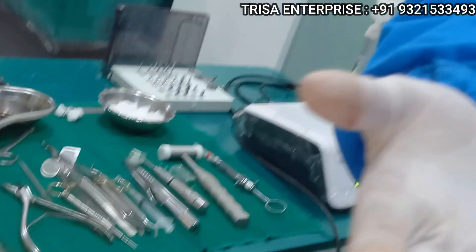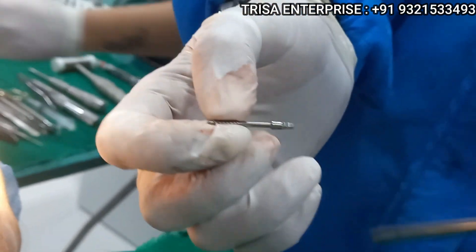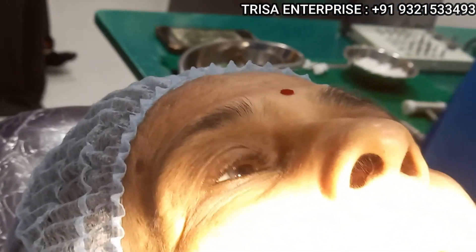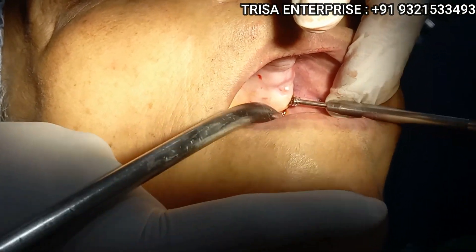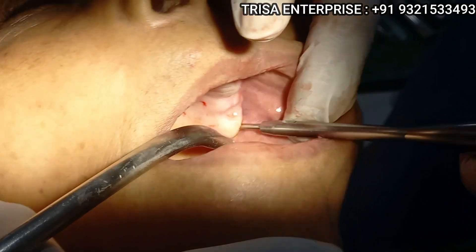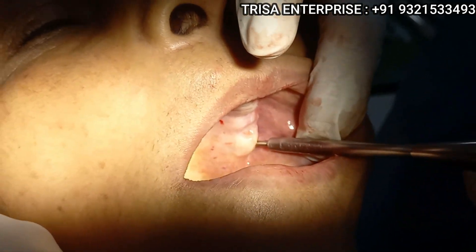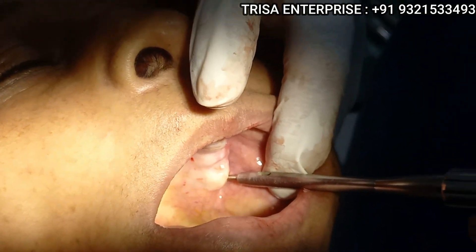Because it has more surface, the implant — I can actually touch it. This is the hand grip. I connected it to the hand grip. Just put the tip in the body. Now look at the torque — I need more pressure to get it in.